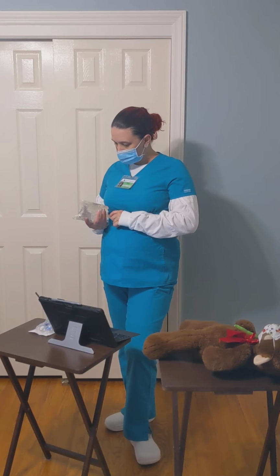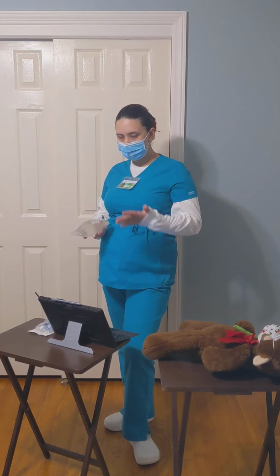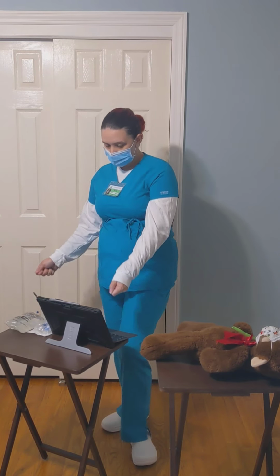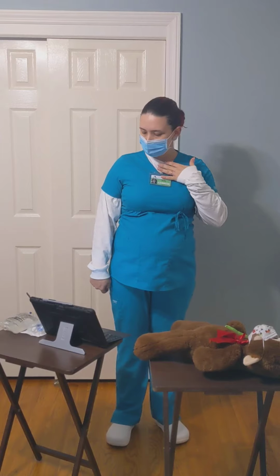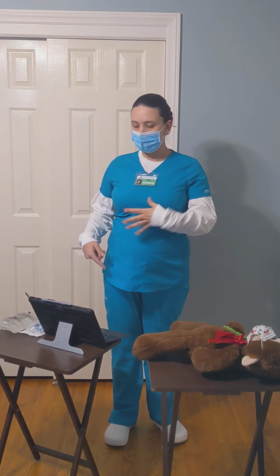Going to check the back for expiration dates. So I've confirmed the label against the MAR that this is the correct medication. So we're going to take a computer cart into the patient's room. Hi, Mrs. Nagel. My name's Marina. I'm going to be the nurse taking care of you this evening. I'm going to go ahead and wash my hands.